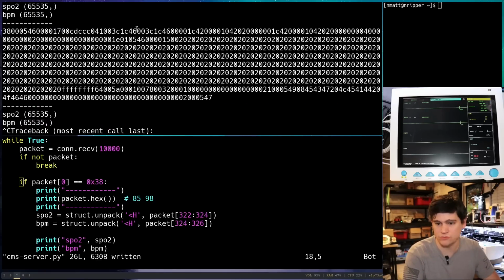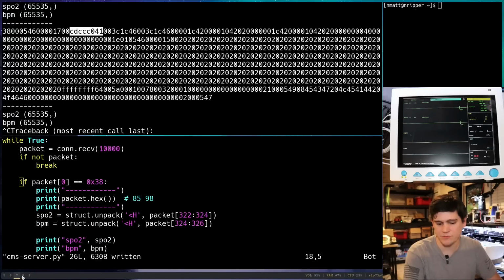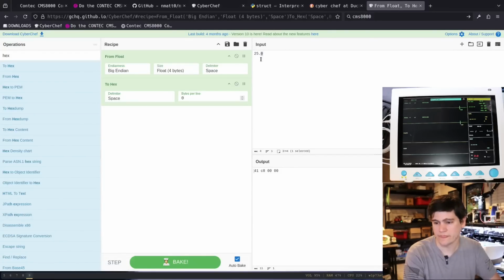So 41, unless I Control C it too fast, which is always possible. There's 41. There's 41 C0. I think I Control C it too fast. So what we're gonna do is we're gonna kind of cheat. Okay, so we see the 41 at the end. I have a hunch that this is it. So if I Control C it too fast, then the temperature would have been higher than it was. Or no, it was like 24.9.